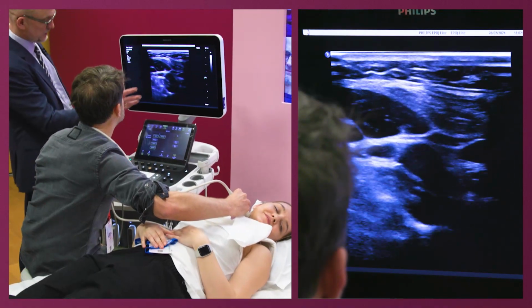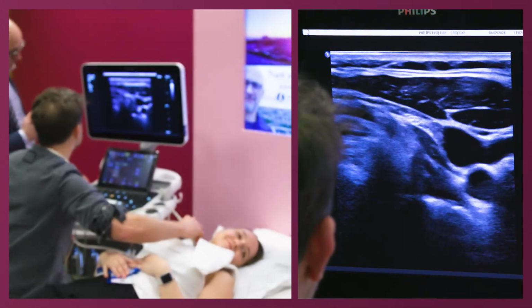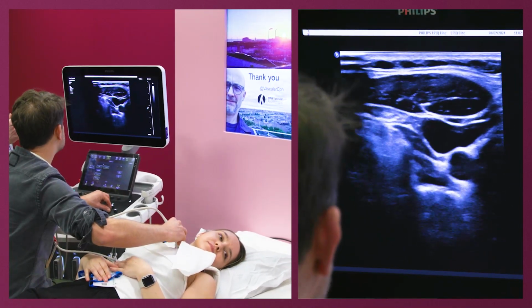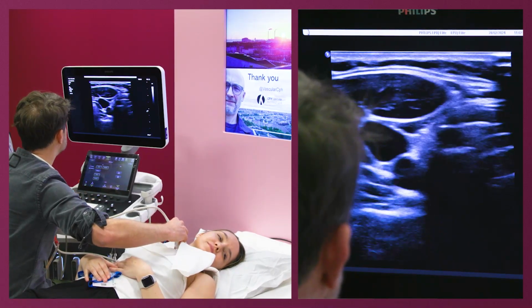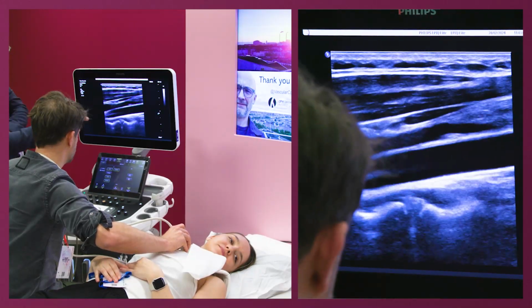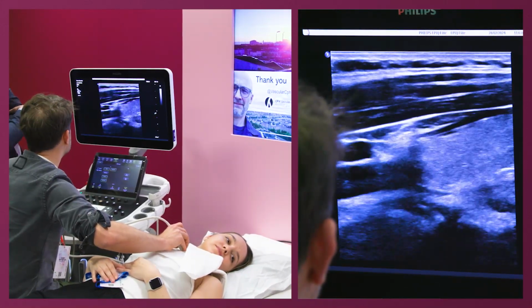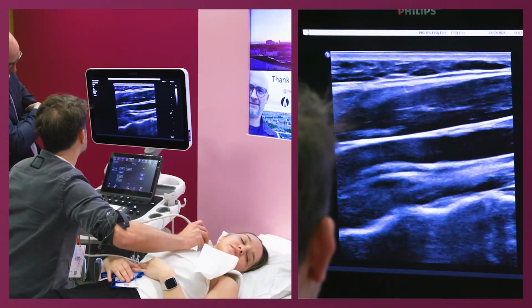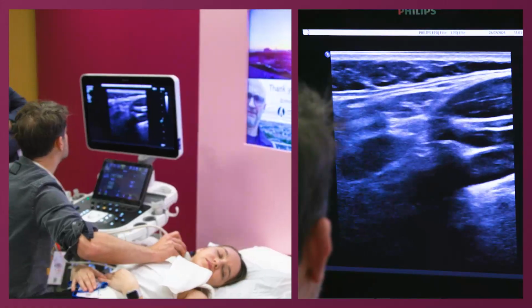Before we start, we should actually optimize the image. You are happy? Okay. It's a good system, so it's a little bit grainy. So the depth you could work with. I think it was good. Then you can adjust the gain. I know you want to push the color, but just keep it B mode, and then wait a moment. Try to go to cranial. Show us the bifurcation. You can see the bulb. Perfect. And then try to keep one end of the transducer, and then turn it like this. See if it gives sense for you.